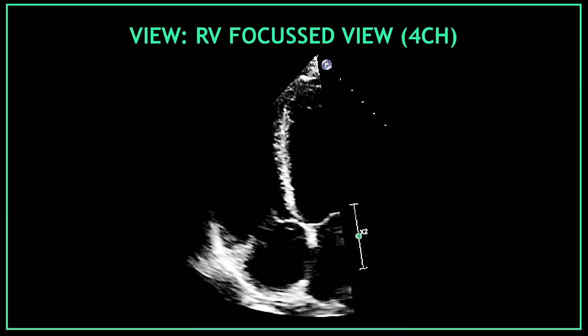And our last view is the right ventricular focused view. This is obtained from the apical 4-chamber view. So I'm going to show you one by one all the minimum dataset you need to obtain of the right ventricular focused view.